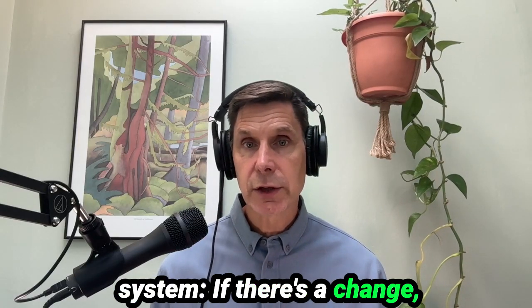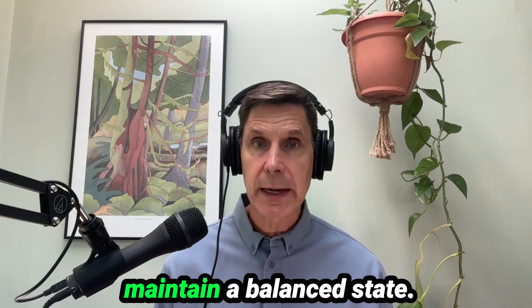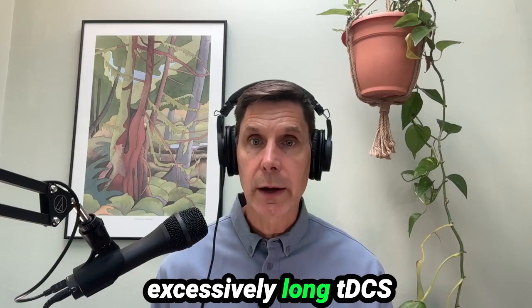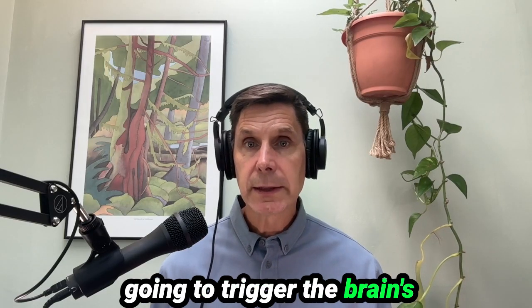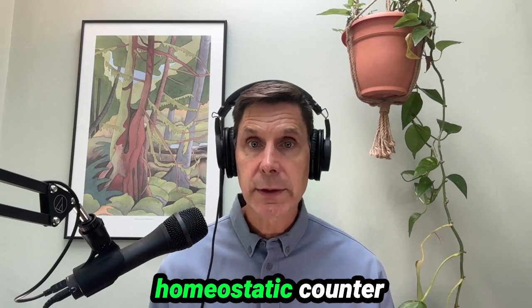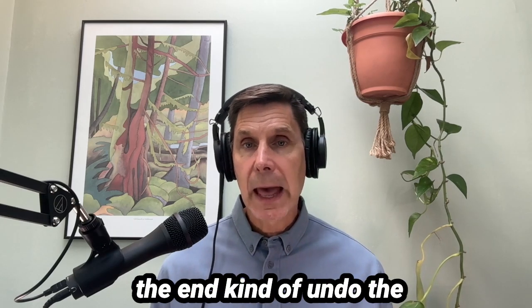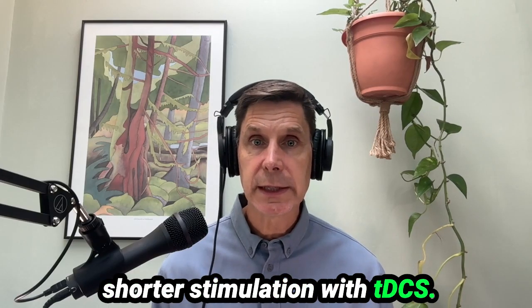If there's a change, the brain in particular will seek to counteract that change in order to maintain a balanced state. So studies showed that excessively long tDCS stimulation is potentially going to trigger the brain's response in terms of a homeostatic counter-regulation, which may in the end kind of undo the positive therapeutic effects of shorter stimulation with tDCS.